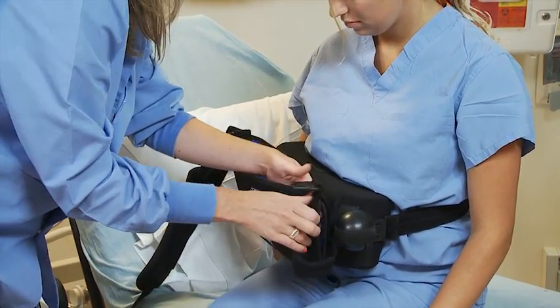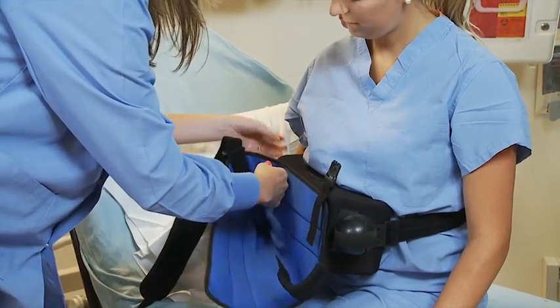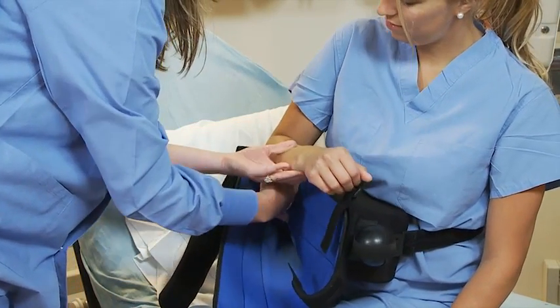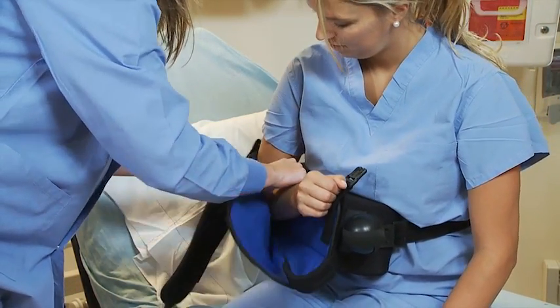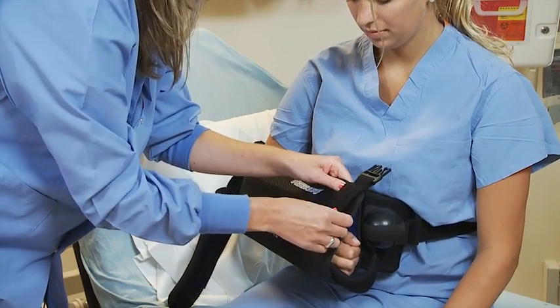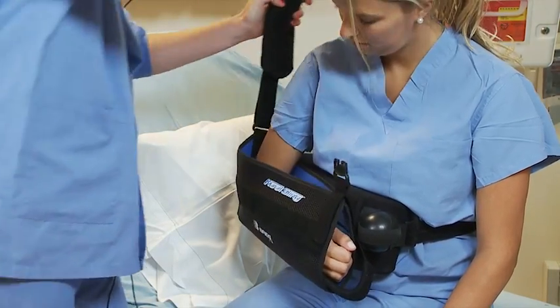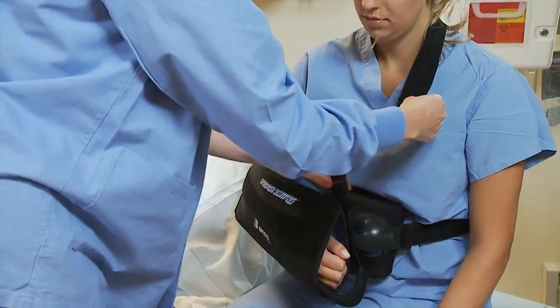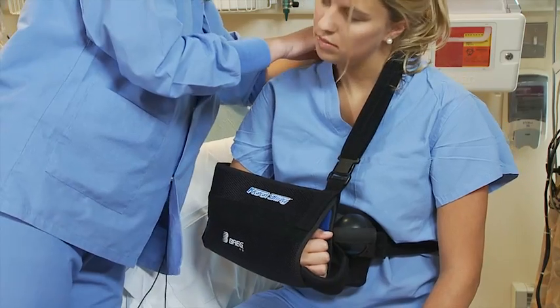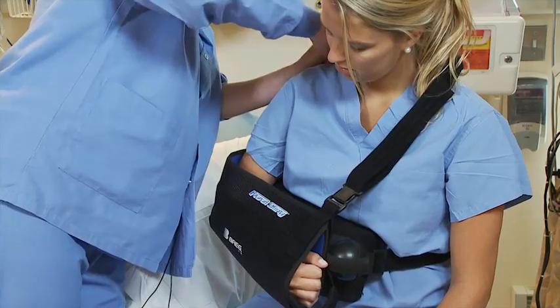You want to make sure we're careful and gently placing your arm. You're going to keep it next to your body and put your elbow right back down in the corner of the sleeve. Secure it there. The strap is going to go up and around your neck and snap in place. We can adjust the shoulder pad so that the neck is supported with the pillow.